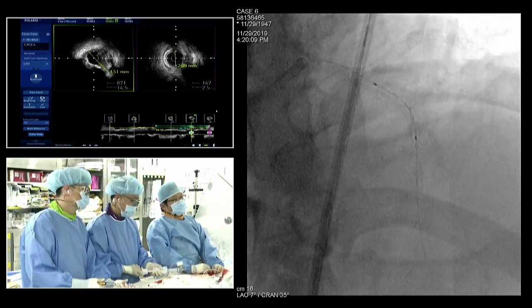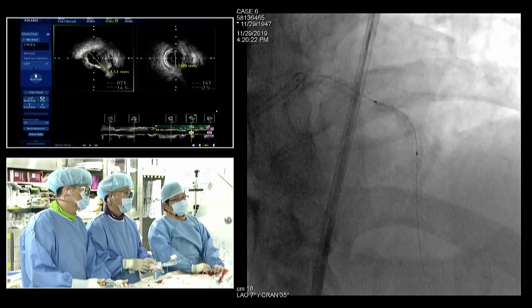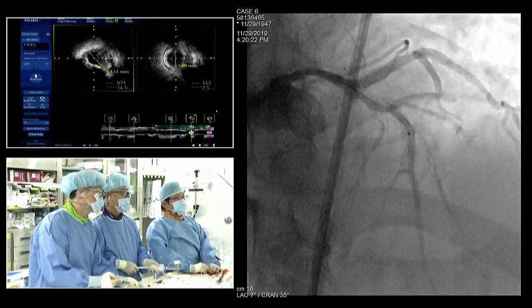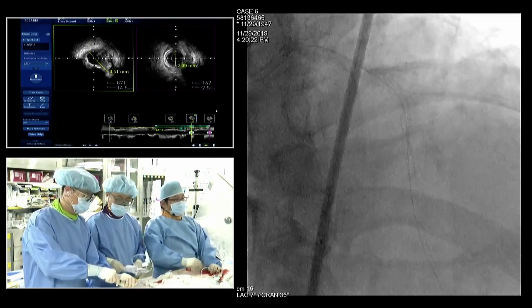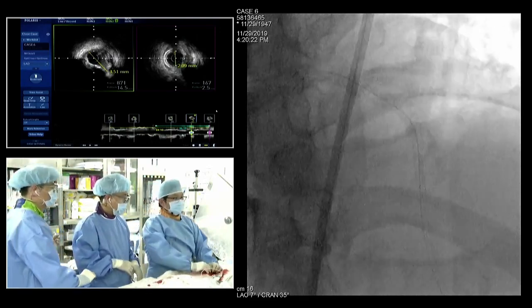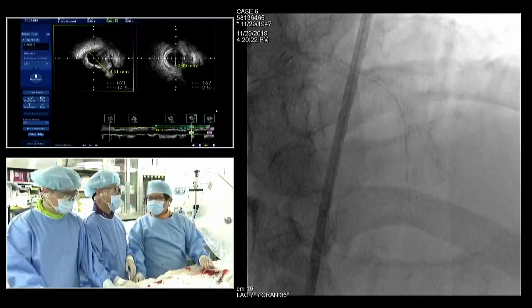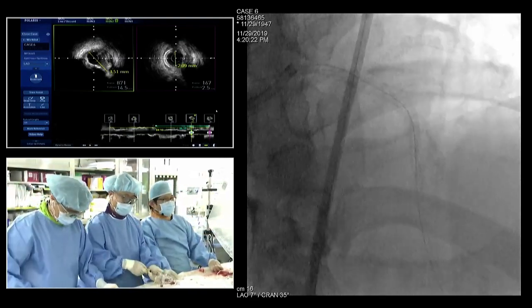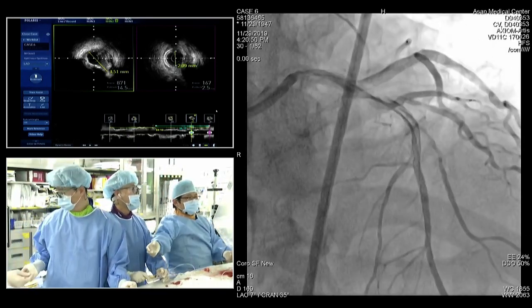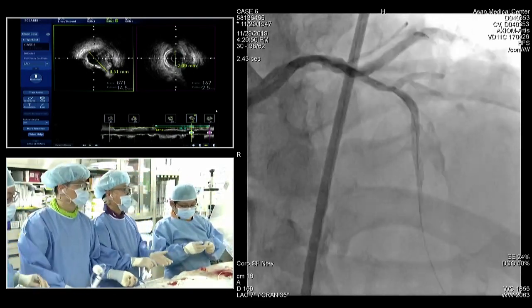16, 18. Deflation. Okay, 3.8, please. Professor Antonio Colombo is concerned about the septal branch. What is your plan? Just go straight? Would you show us the septal branches? You may need another stent for that. Okay, good. Oh, it's already gone. See, it's gone. You should never finish the case with fewer branches than you start.